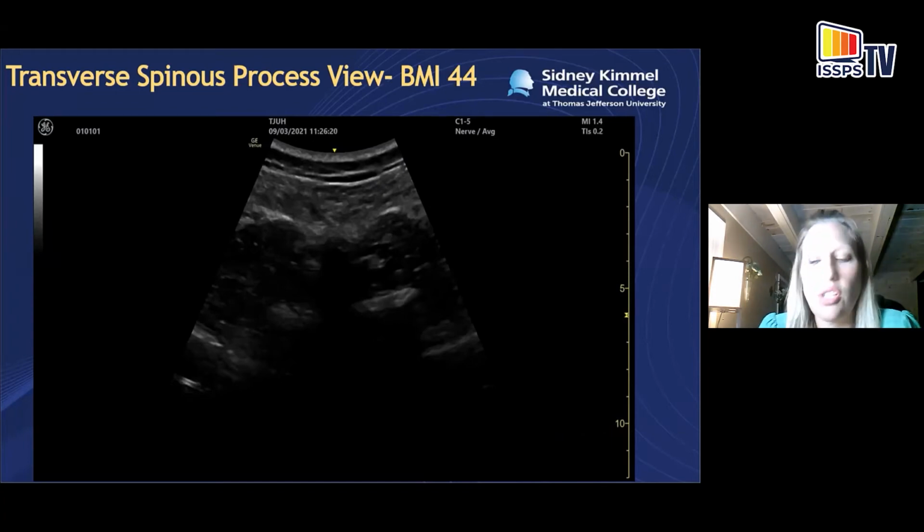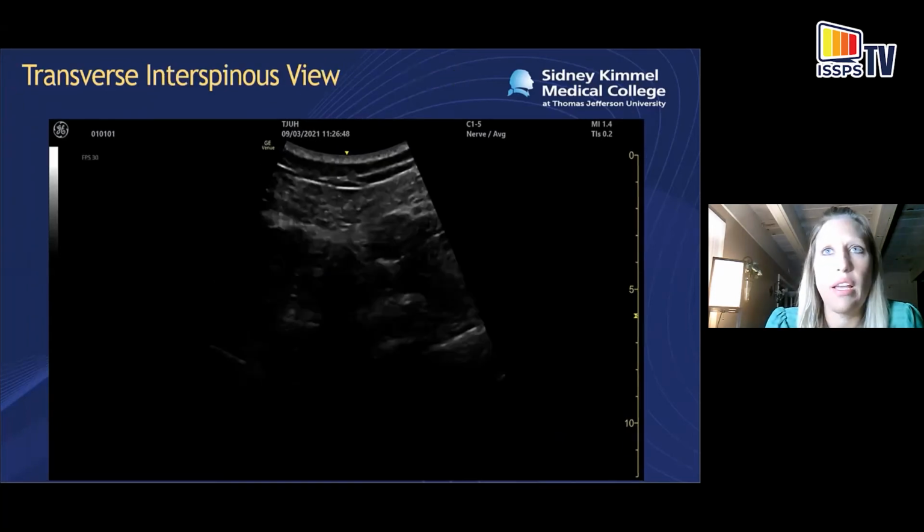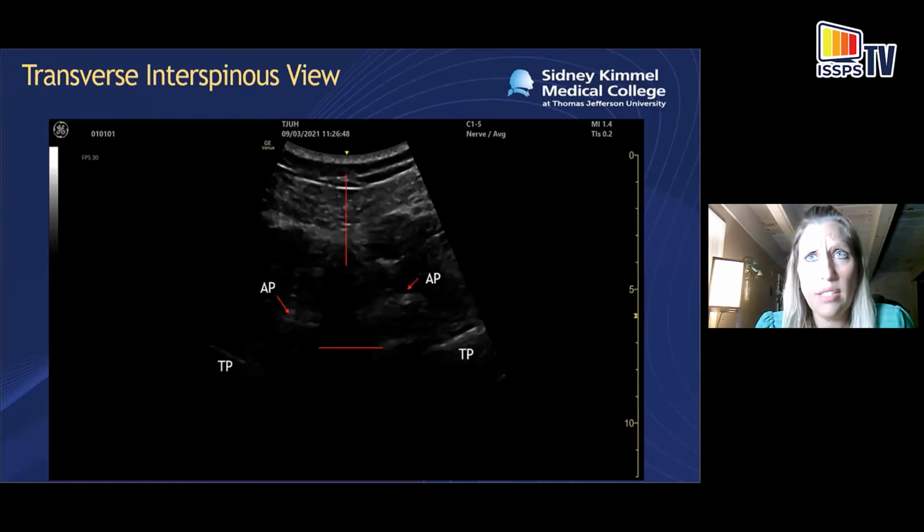So I first started looking for my spinous process and my midline, and here you can see the spinous process and there the lamina. So it's kind of the swan taking flight. That gave me, we were able to mark midline, then moved in to look for the interspinous view into the interspace. And we could see the shadow of the interspinous ligament. You can see the articular process there.